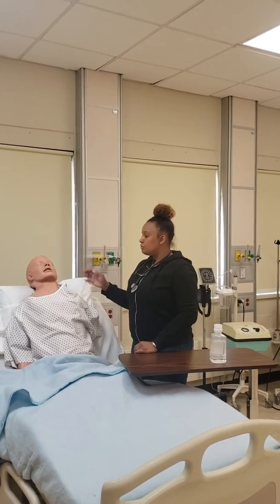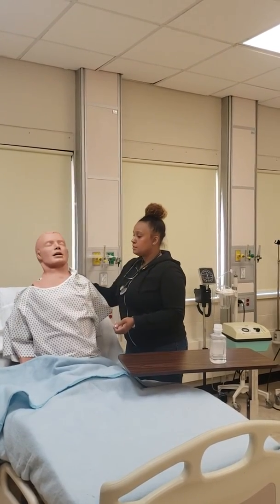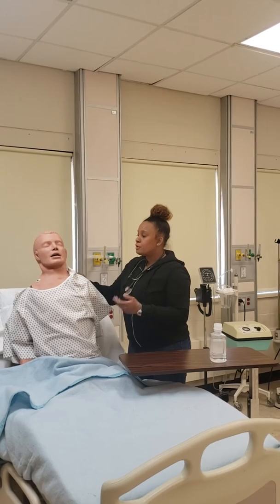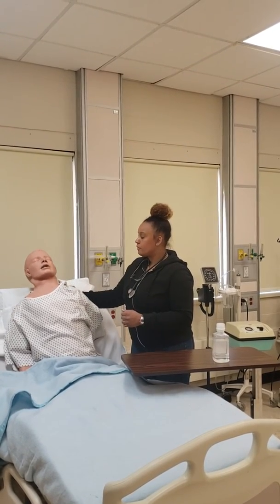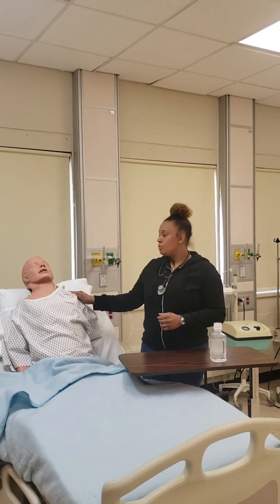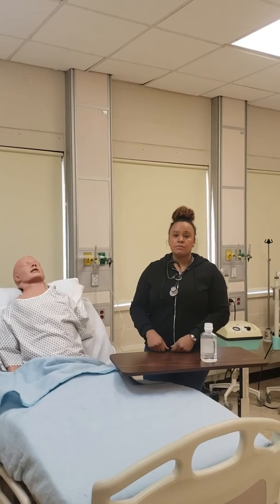I will instruct the patient, may you please sit up for me? Nice. And I'll ask them, may you please cough for me? Good, cough it all up. I will now wash my hands again for at least 15 seconds, and I will document in the patient's chart.